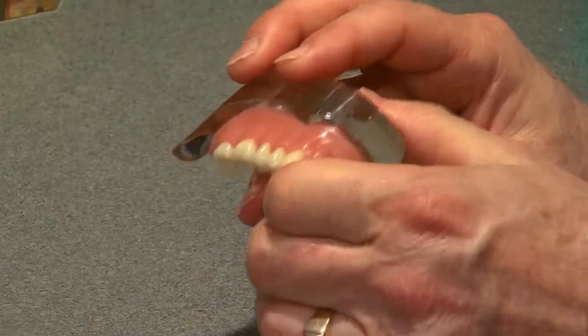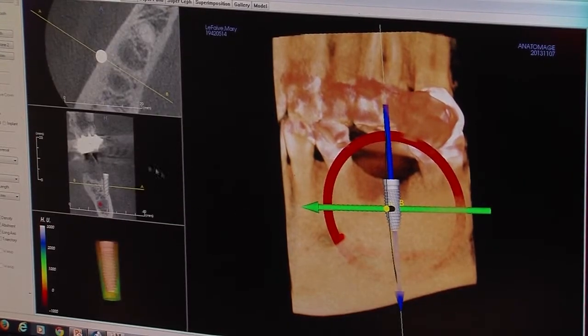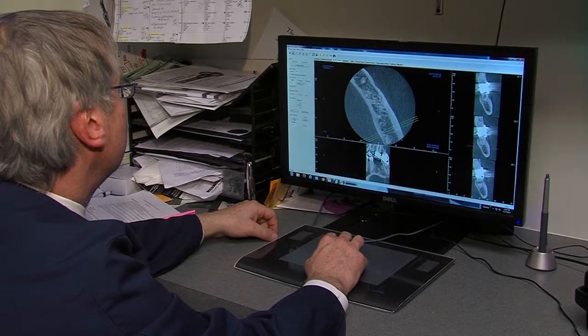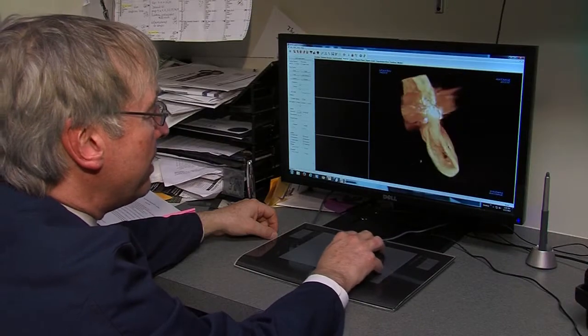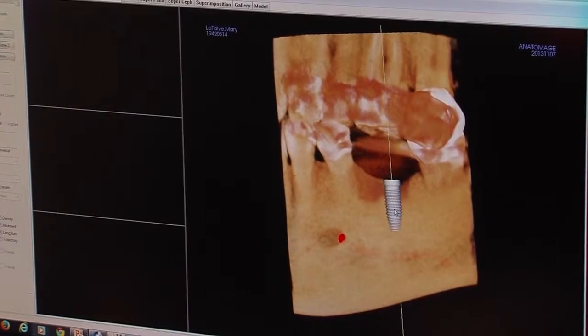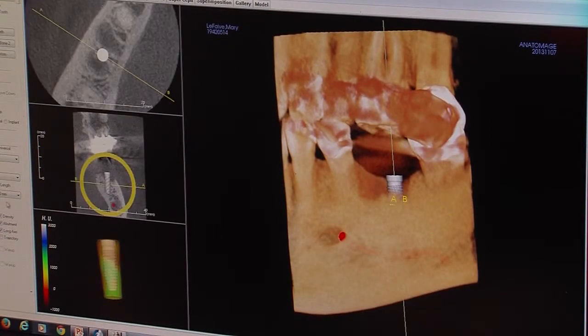Dr. Harmon says implants have been around since the 70s, but the way they're put in is more precise thanks to 3D imaging. In the old days, you looked at a two-dimensional picture, and it's kind of like looking at a box. In 2D, you're looking at a square. If you're looking at a box in 3D, you're looking at a cube. So you can tell depth. You can even tell the bone quality, the thickness, the density, before you even go in there. That way, Dr. Harmon knows the exact size of the implant he needs before putting them in.